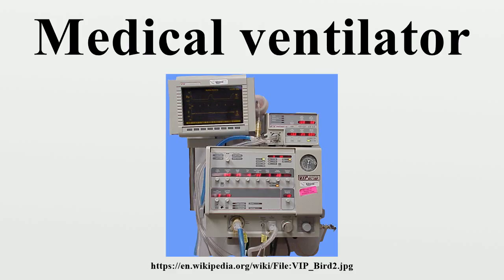Ventilators may also be equipped with monitoring and alarm systems for patient-related parameters and ventilator function, backup batteries, oxygen tanks, and remote control. The pneumatic system is nowadays often replaced by a computer-controlled turbopump. Modern ventilators are electronically controlled by a small embedded system to allow exact adaptation of pressure and flow characteristics to an individual patient's needs. Fine-tuned ventilator settings also serve to make ventilation more tolerable and comfortable for the patient.